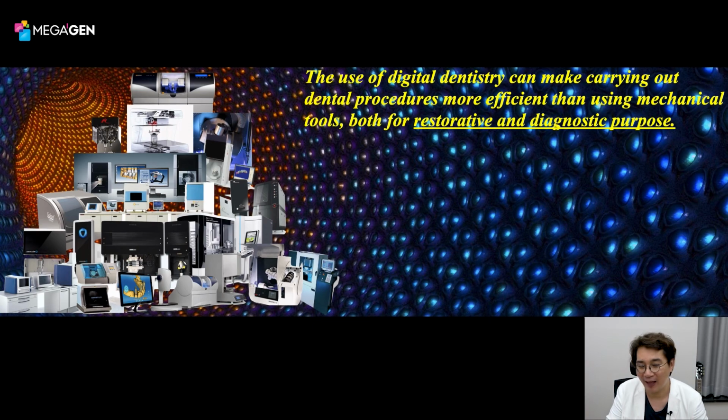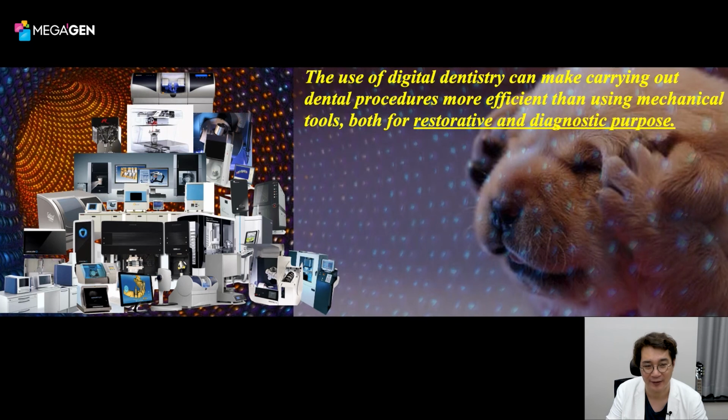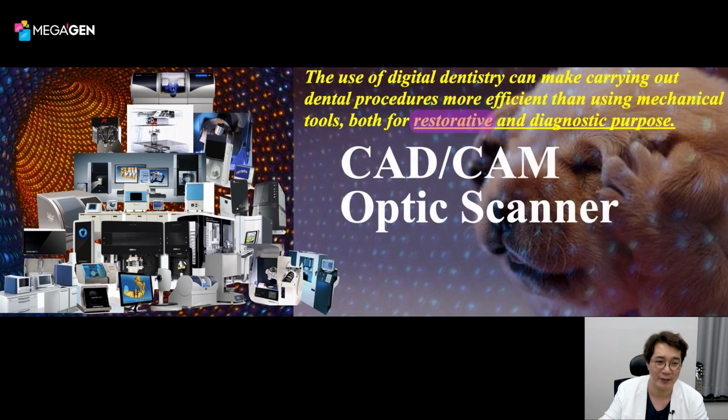Unfortunately, recently a lot of companies advertise about the restorative things. That's why when we meet the CAD/CAM technologies, we feel some headaches. Because a lot of the companies say like this: if you purchase our CAD/CAM system and our scanner, you don't need the conventional impression, and you can design the prosthetics by yourself, and you can manufacture the prosthetics by yourself. It's cool.